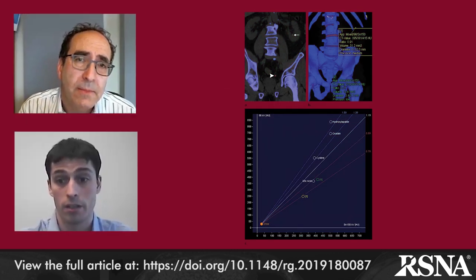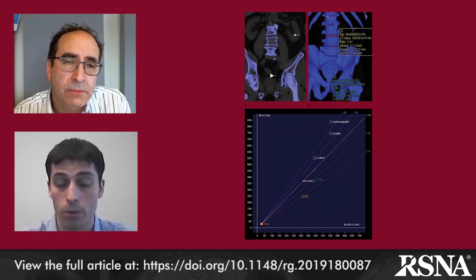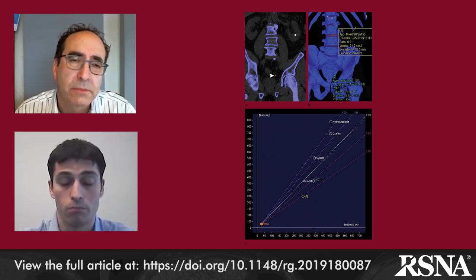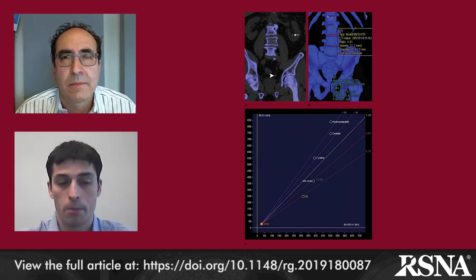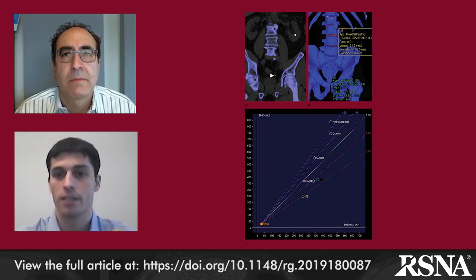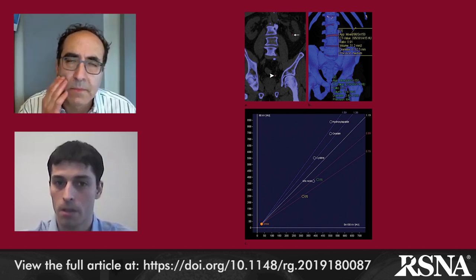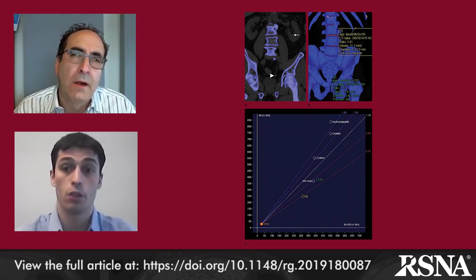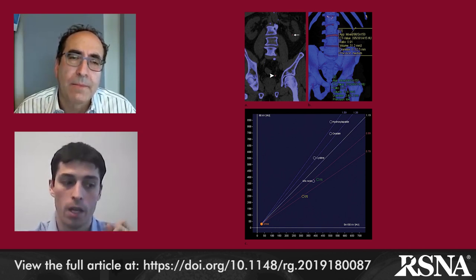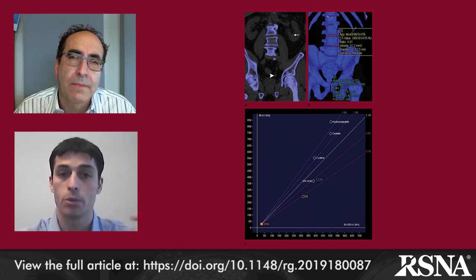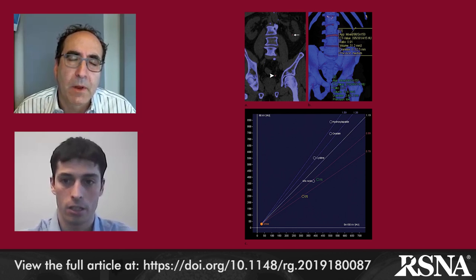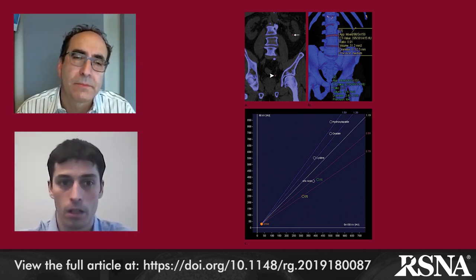Can you review this topic with us, and then we'll look at Figure 19 which demonstrates the strengths of dual energy CT in urinary stone analysis? As you mentioned, renal stone evaluation has been really well studied and is probably one of the most commonly used applications in abdominal CT. Definitive treatment of urolithiasis depends on the location, size, and chemical composition of the stones. Approximately 90% of these stones are made of calcium, while approximately 10% are made of uric acid. It's extremely important to identify uric acid stones since they can be treated medically with urine alkalinization, which will not work for calcium-based stones.